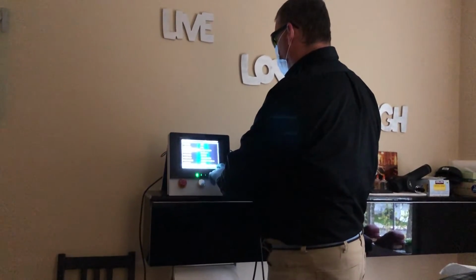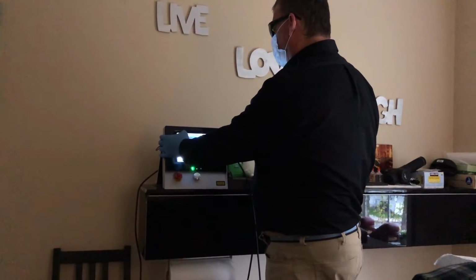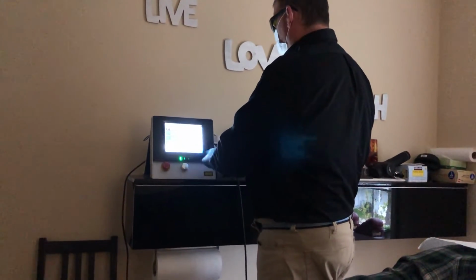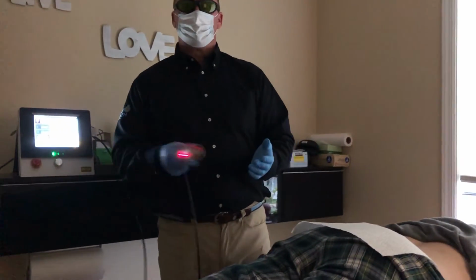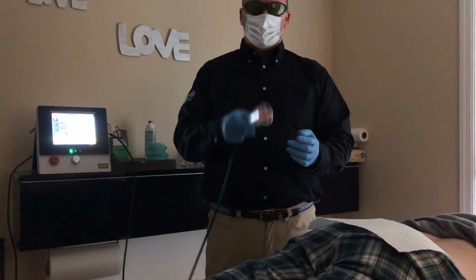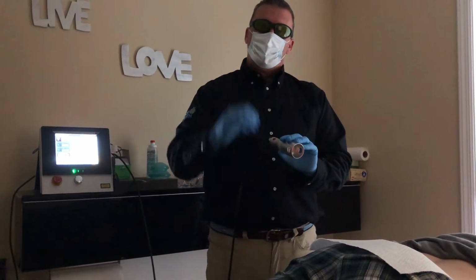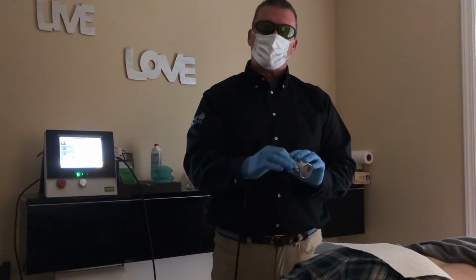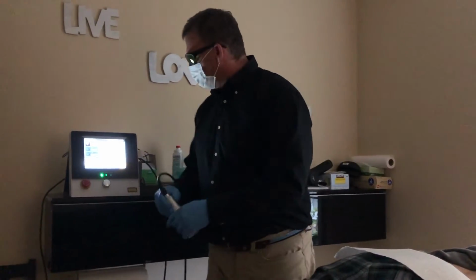I'm going to use a lumbar, let's go large. And now, what you see is how powerful this laser is. What the laser does is it emits photons, which are packets of energy, into the area, and the water molecules, those tiny little water molecules, will respond by increasing microcirculation. So let's get right down to it.